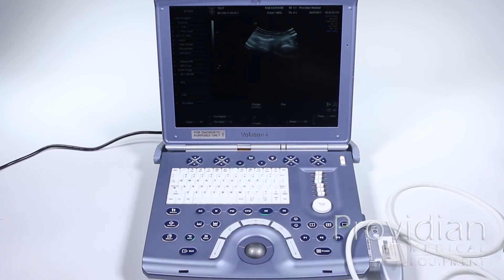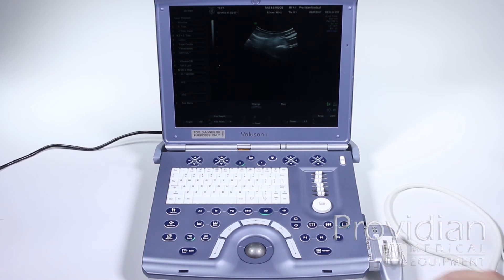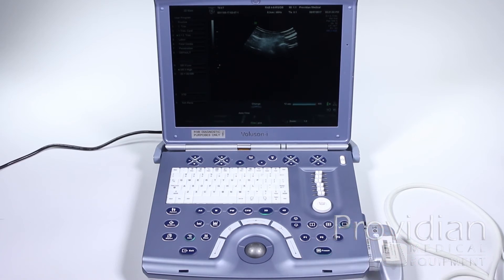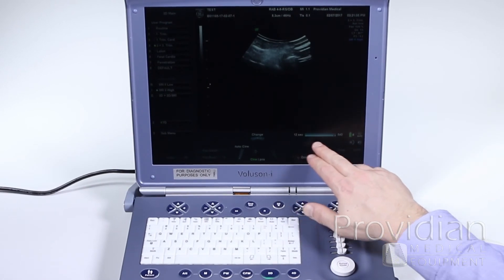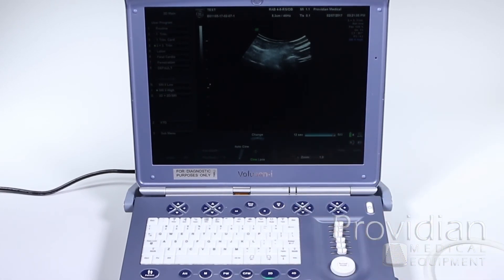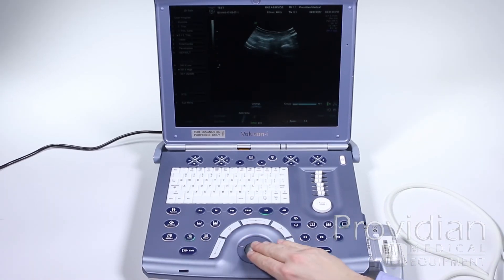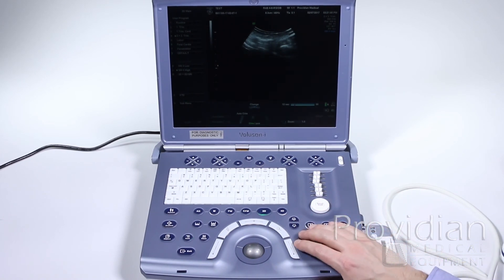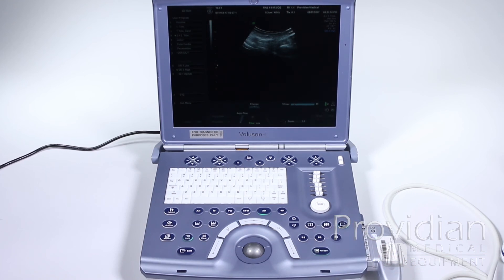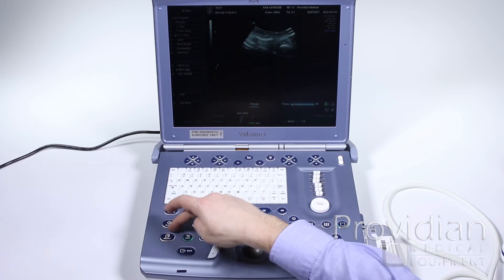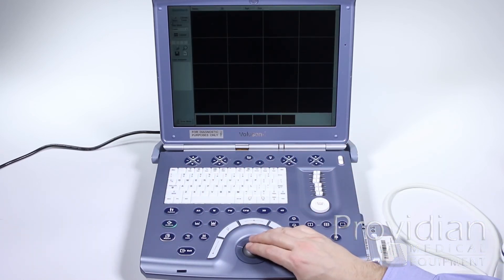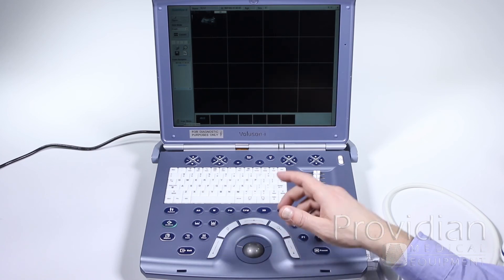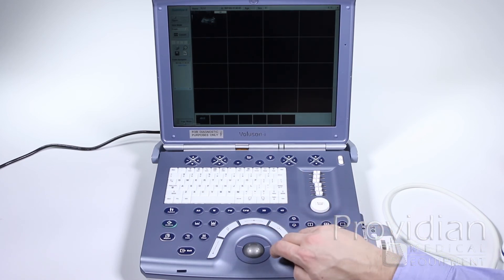Let's take a quick look at how to save and store images. Go ahead and hit freeze to freeze the image — it automatically goes to something called Cine Review. Here it shows I have 12 seconds saved, or 543 frames, so I can scroll back through that last 12 seconds of scanning. If I see an image I like, I'm going to go ahead and press P1. It went ahead and saved that image — it said saving in progress. If I now go to my archive button and click on current exam, we can see that it did save that image in there. We will go into SonoView, which is the image archive, and exporting in a later chapter.